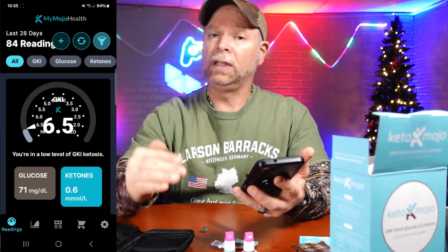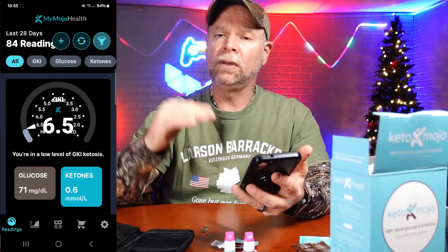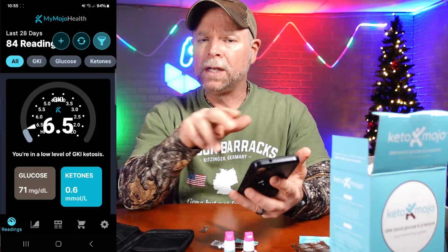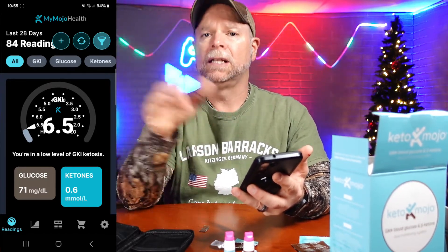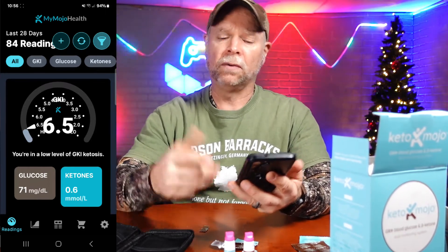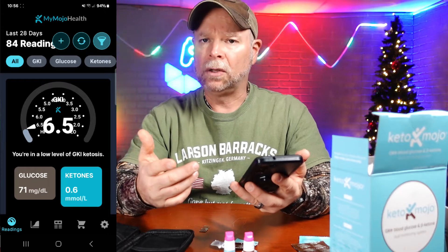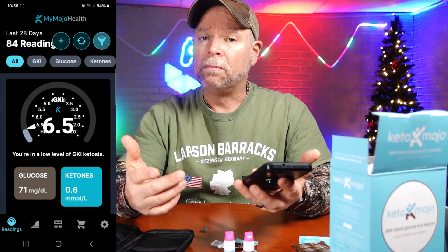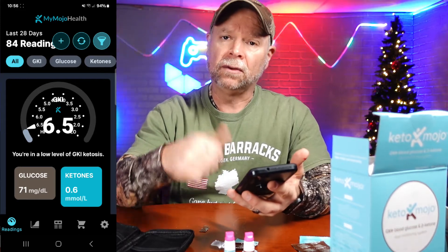There are several different levels of ketosis: a low level, moderate level, high level, and then a therapeutic level. They go one to three, then three to six, then six to nine. Outside of nine you're really not in ketosis. Being at a 6.5 I'm at a low level. If I hadn't had the bone broth, there's a good chance my ketone level would have been up.